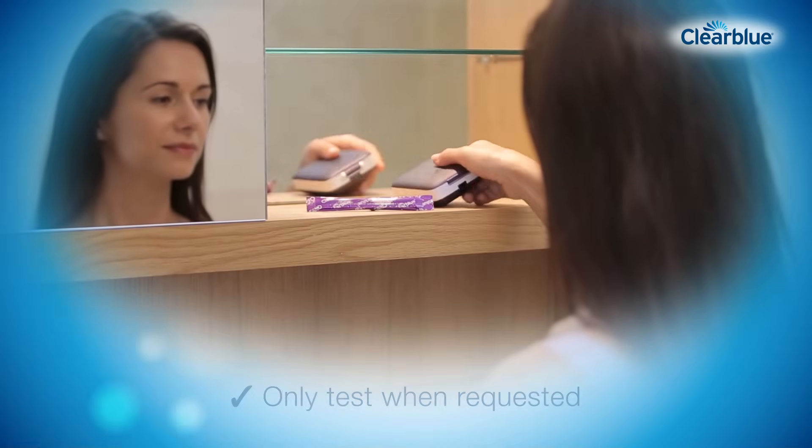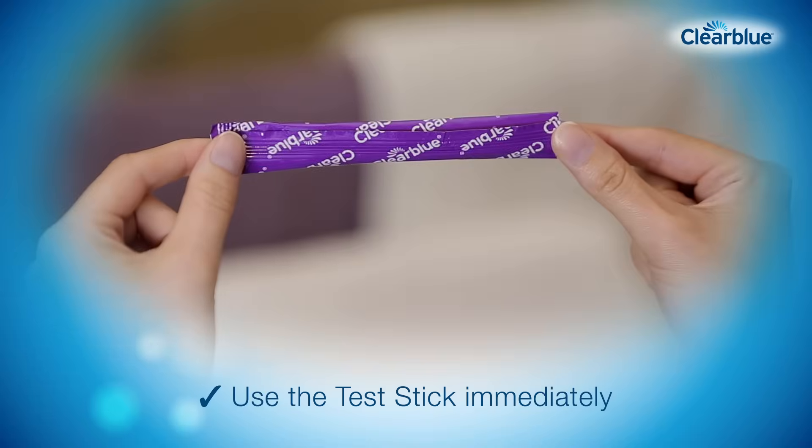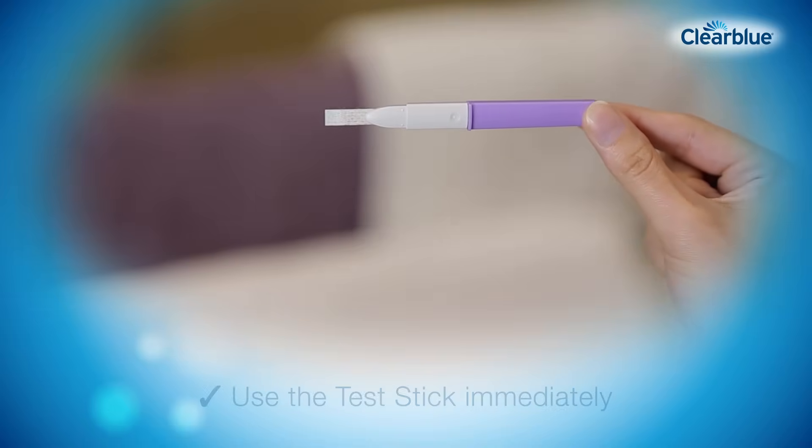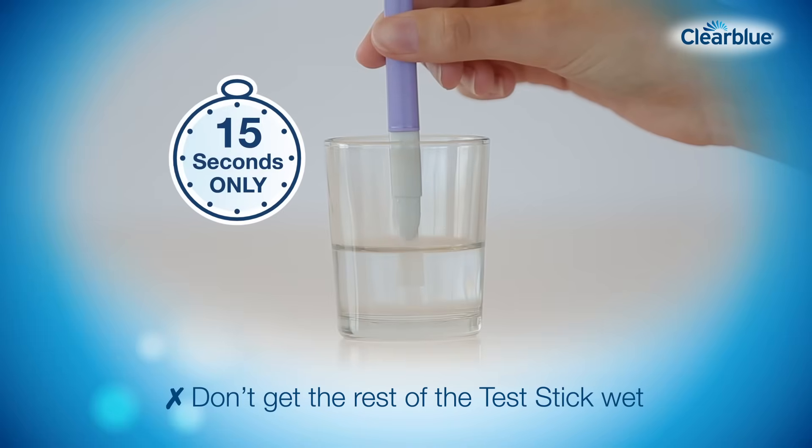To perform a test, we recommend you collect a sample of your urine in a clean, dry container. Remove the test stick from the foil. Immediately place the sampling end into the urine for 15 seconds only.